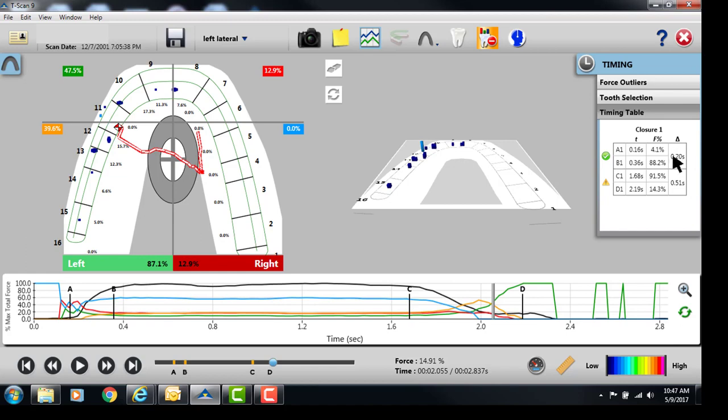At this point, at this time, it's 0.20 seconds, and you'll get a green check mark saying that's a good standard to be within. It will turn red if it's above what some of the research that we use recommends. It'll have an exclamation point if it's on the edge of that. So for example here, originally we had a stop sign, and you can go back in the video and look at that real quick, but you can see that it's an exclamation point, meaning that we've improved but we're still on the border. Ideally we would want this D line, you can see as I move it, to move closer to the C line, and you can see the check mark pops up.